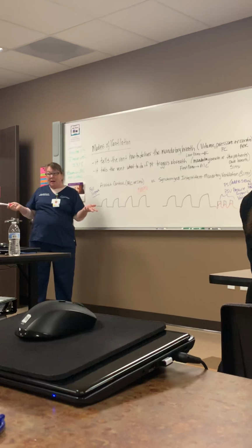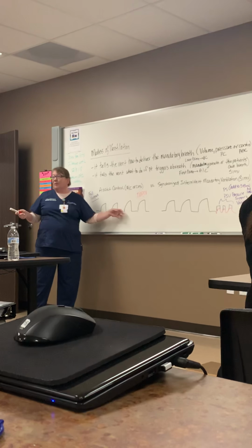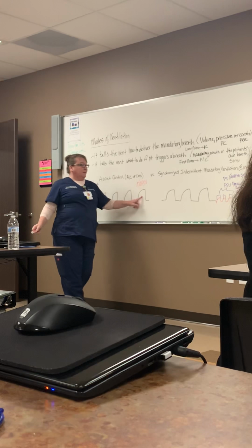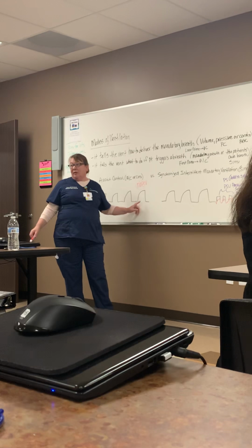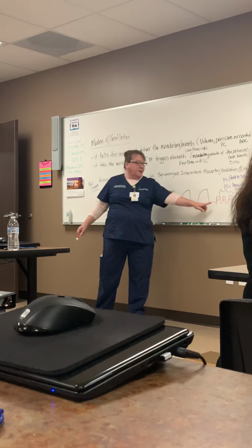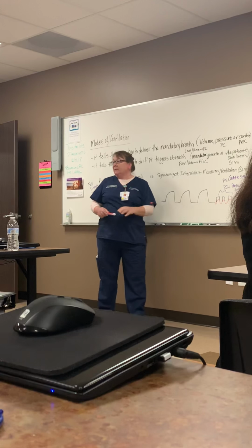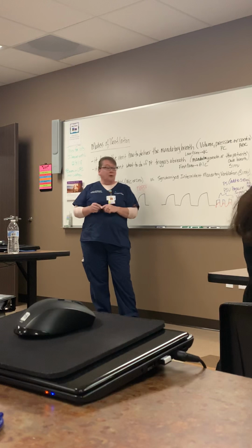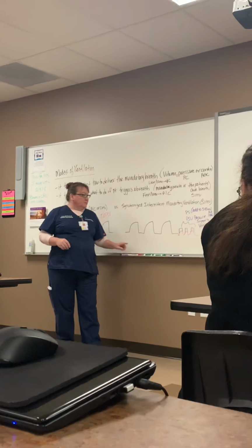So you would have to tell us that that's not an option. And why is it not an option? Because there's no spontaneous breaths. If my patient breathes in, they're going to get a machine breath. They could trigger it, but there's still no spontaneous breathing like there is over here. Does that make sense, you guys? Okay.